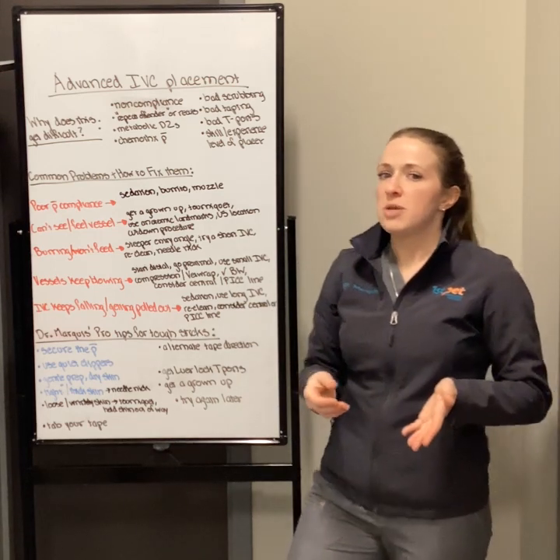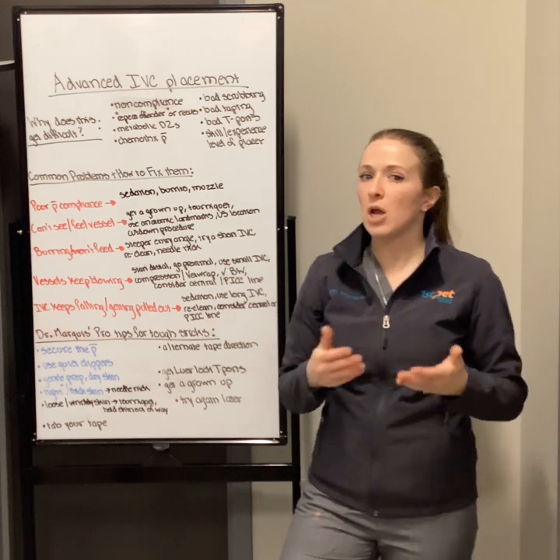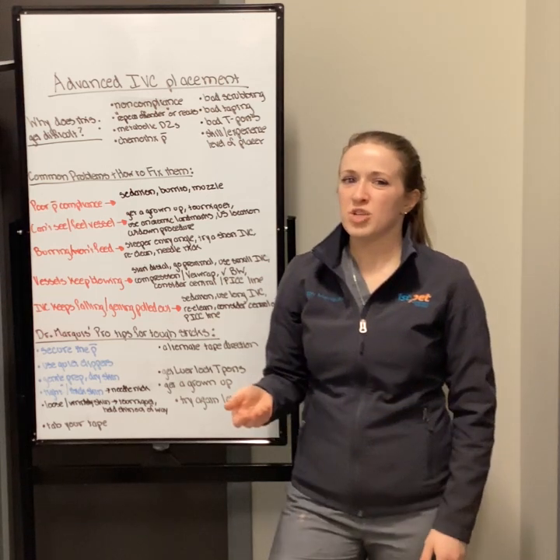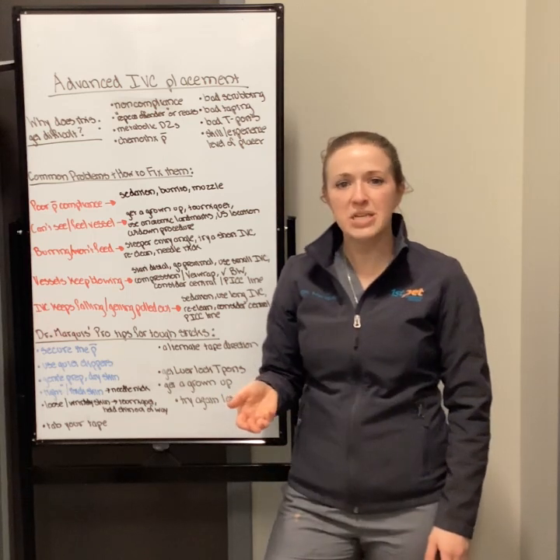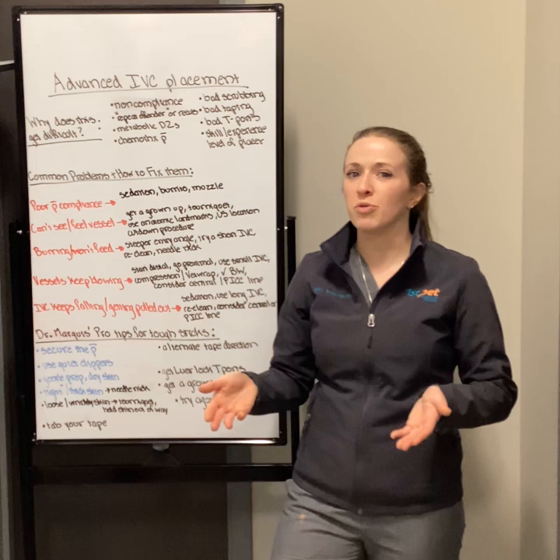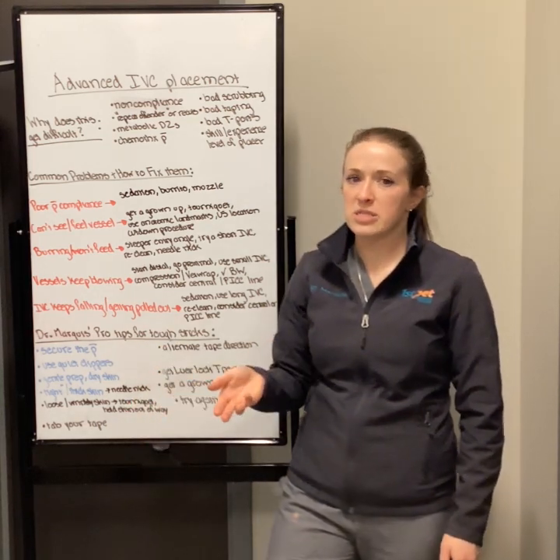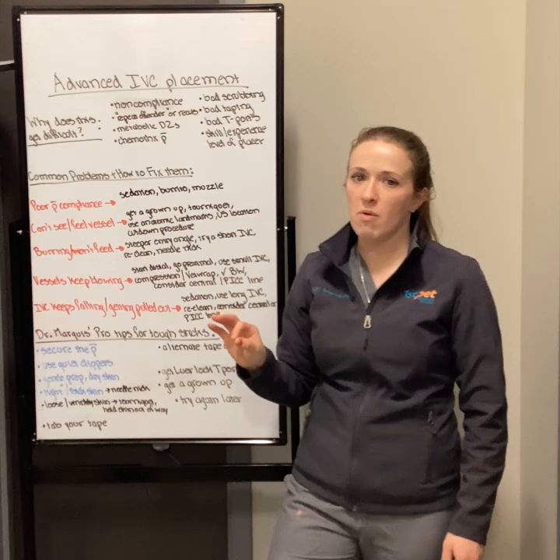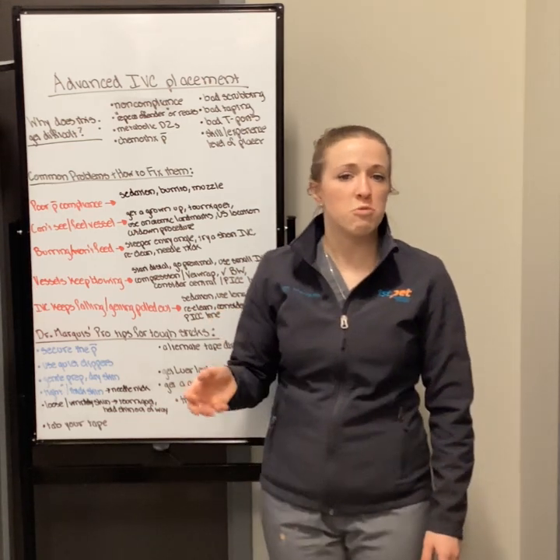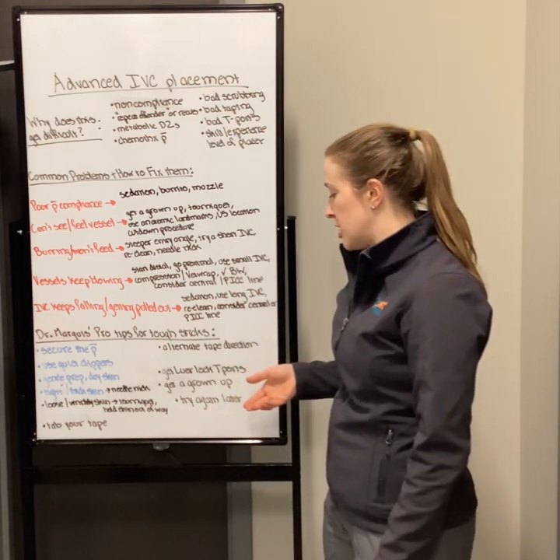The problem with slip tips is that even if you put on a so-called security strap or bra strap, you cannot guarantee that that catheter is not going to fall out. Not only is this frustrating, but it can make the catheter messy if there's blood around it. The other thing is that we talked about how if there's blood or liquid or prep solution under your tape, it doesn't stick, and blood is a great way to grow an infection. So I would strongly recommend getting luer locks. I just find them to be a lot more secure and they hold up well over several days of hospitalization.